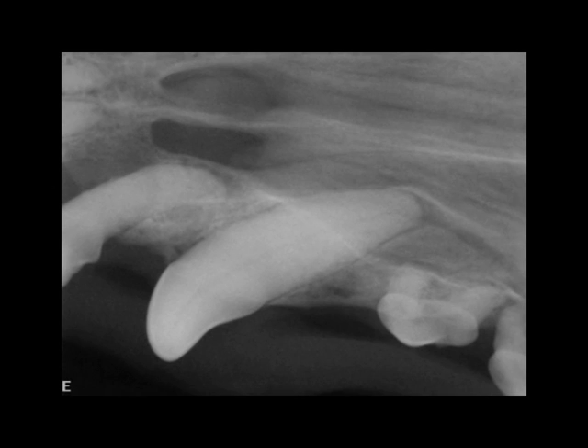This is the tooth on the other side — the upper left tooth. Look at where the bone height is: it's nice and high. In guided tissue regeneration we cannot bring the bone up to where it was originally, but we can build up the lost bone in the deep pocket beside the root and give it more support. This also prevents a hole called an oronasal fistula from developing — a hole that goes from the mouth to the nose. The pet gets an infection in the nose from food going up into it, and they sneeze a lot and can have discharge draining from their nose.